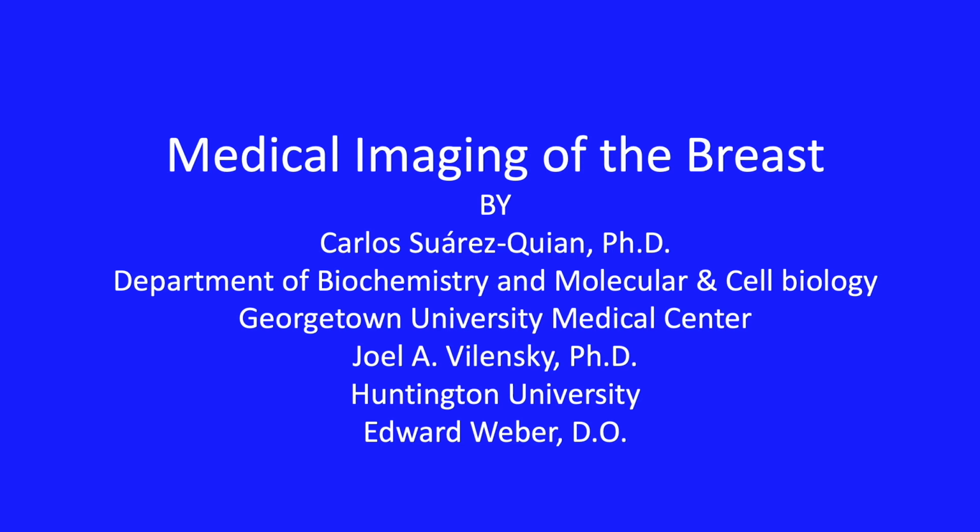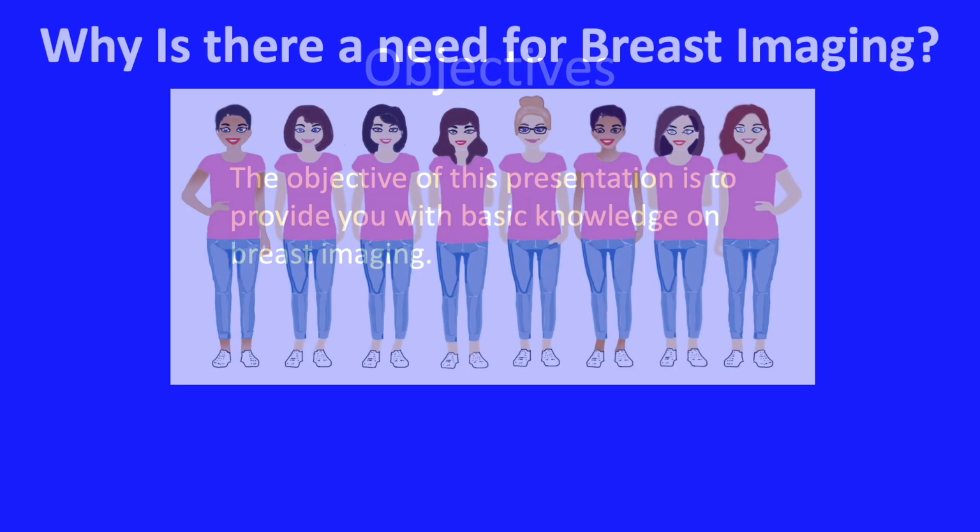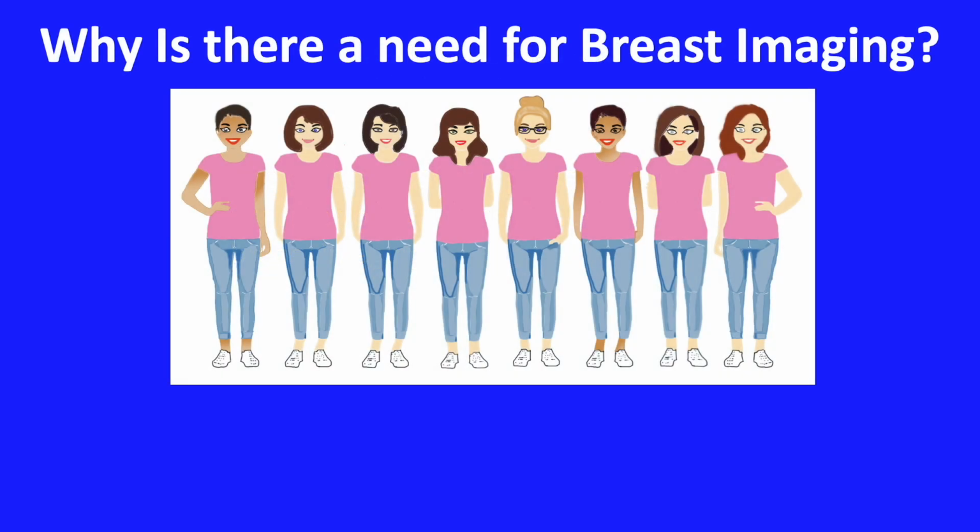Suarez-Quian. Let's begin. The objective of this presentation is to provide you with basic knowledge on breast imaging. Let's start with the obvious question. What is the clinical need for breast imaging?